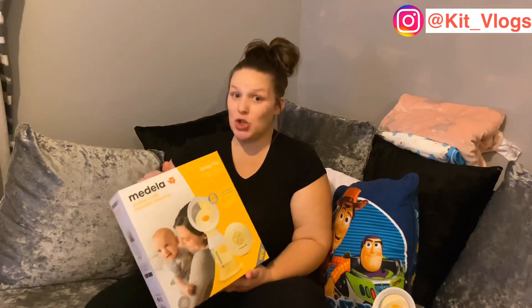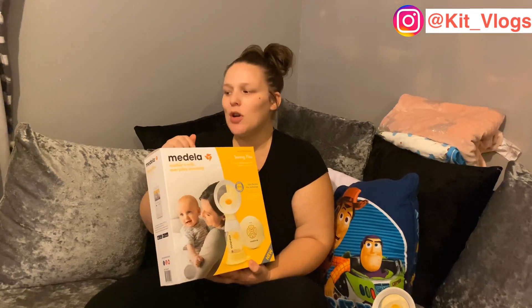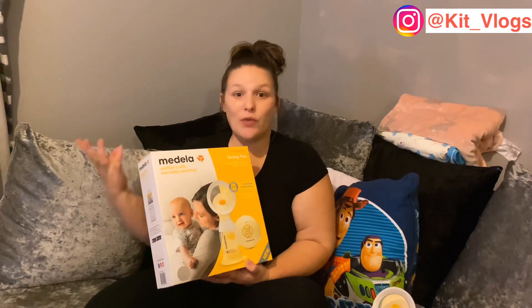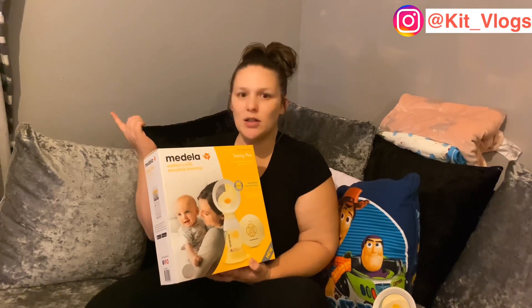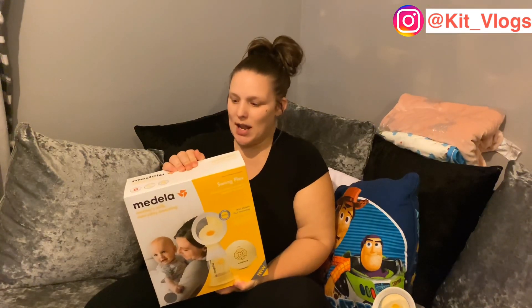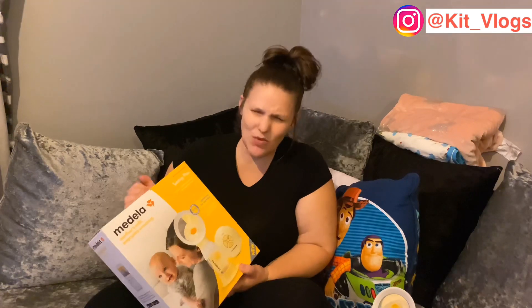You really do get loads of milk. I've got a picture on my phone from when I first started pumping — I think it was the third or fourth time — and bear in mind I was getting nothing from pumping previously. That time I think it was over 100ml. I'll insert the picture if I can find it. It's brilliant and comfortable to use, and I like the fact that I can use it on the go without needing the adapter.